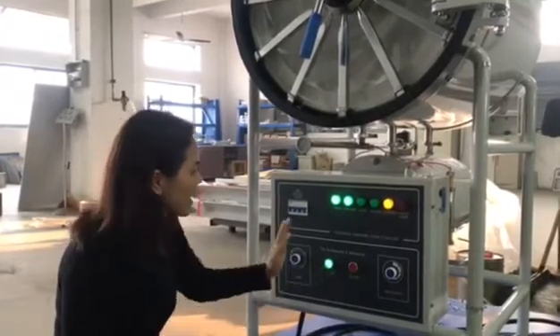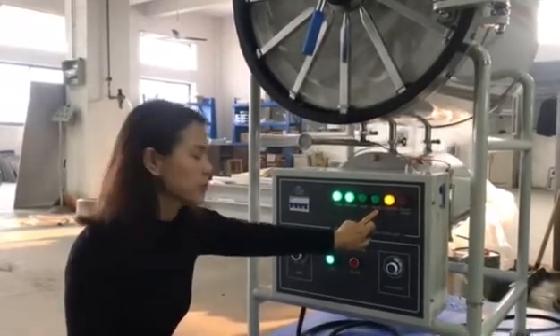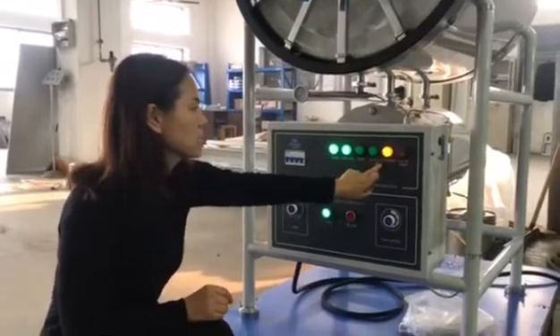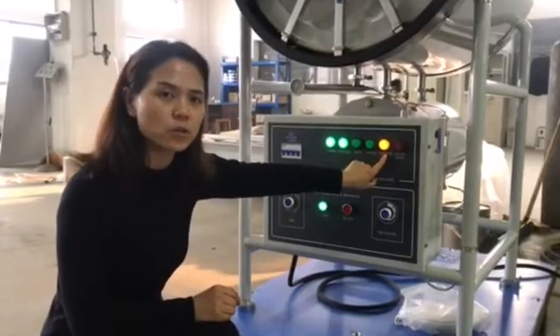Then it will start the heating process. The heating process will turn green. Then it will start the 30-minute heating. After heating, this heating button will be off. Then it will start the sterilizing process.